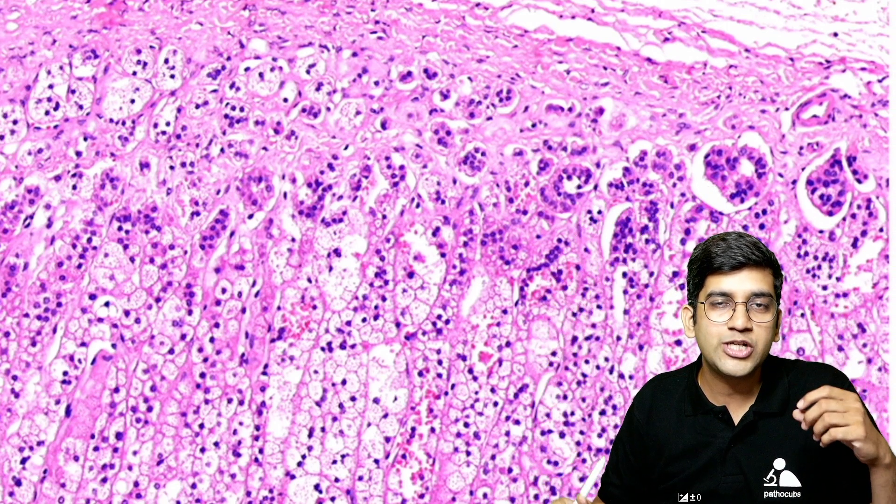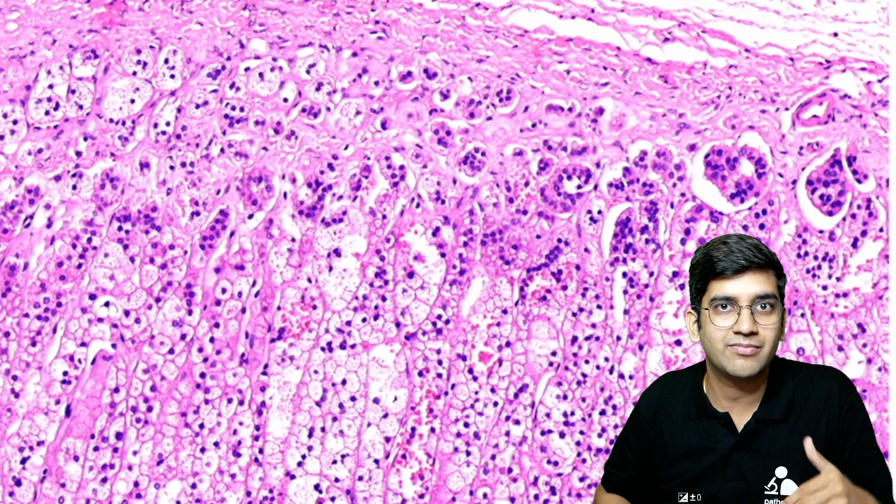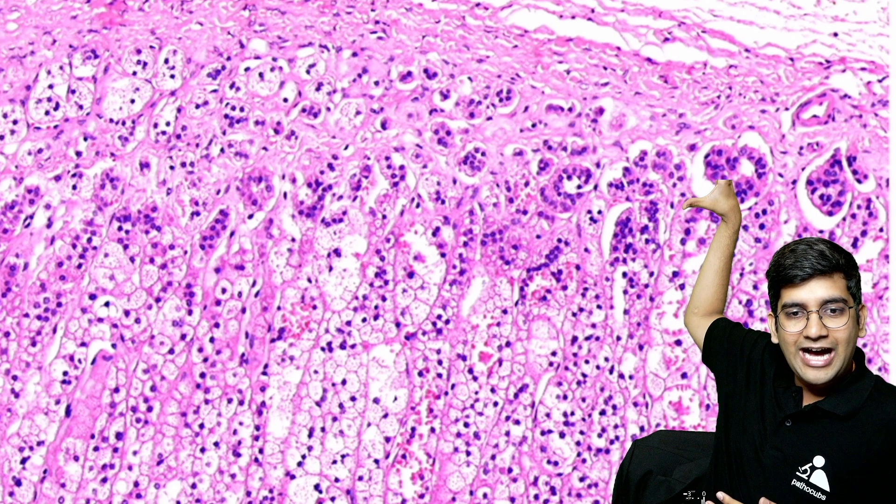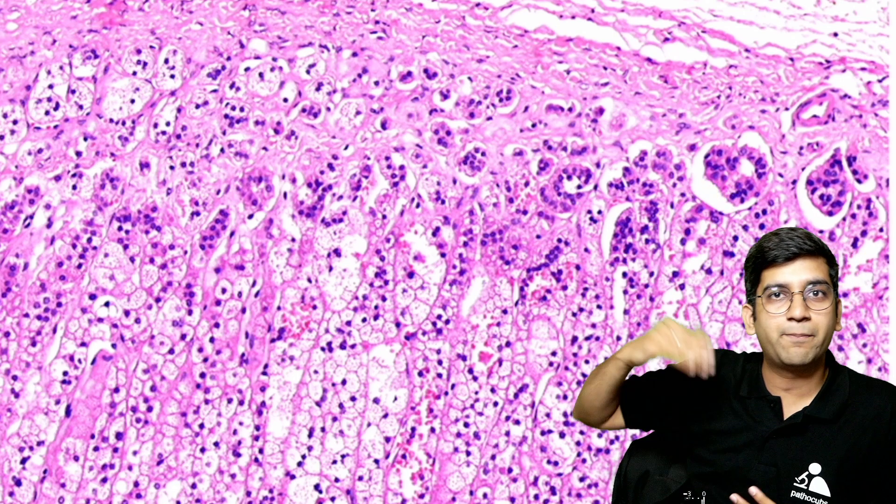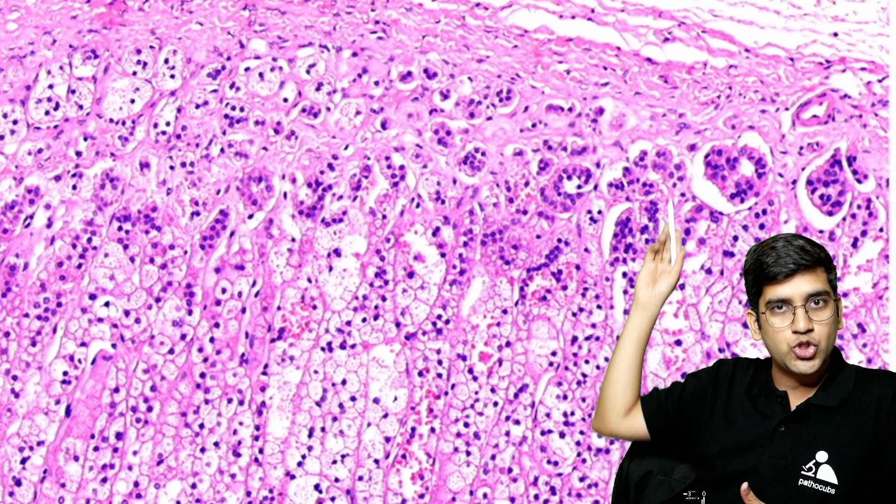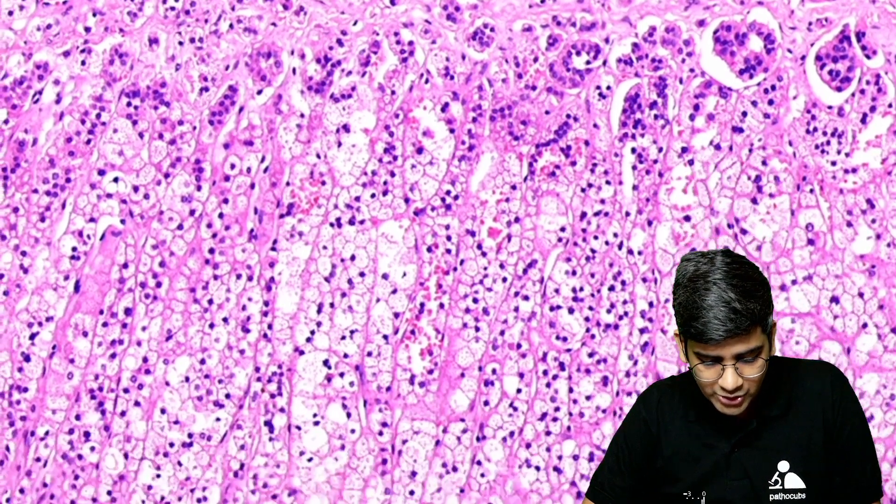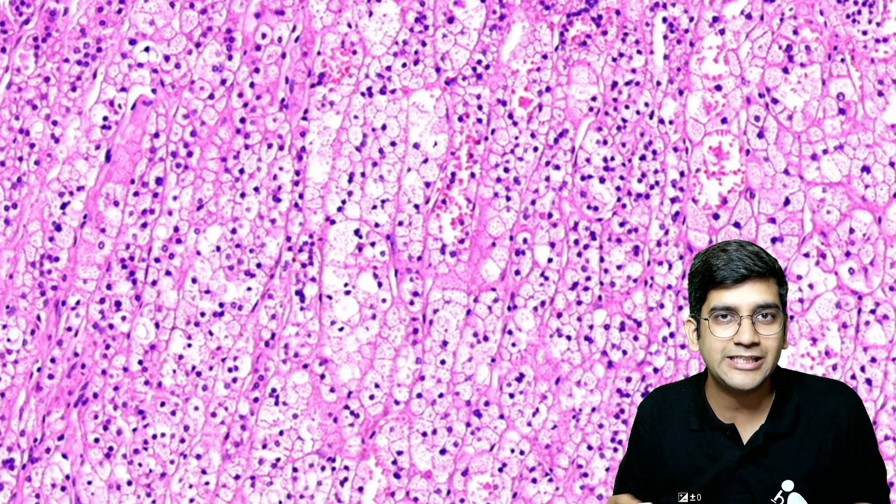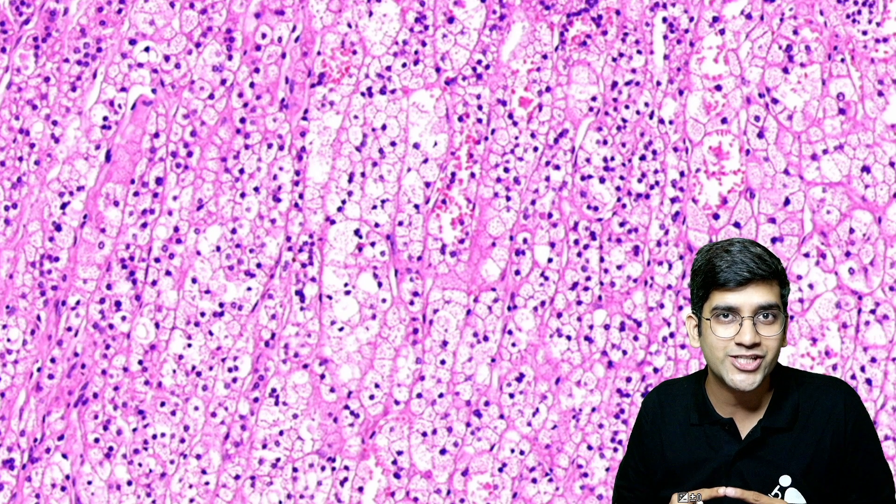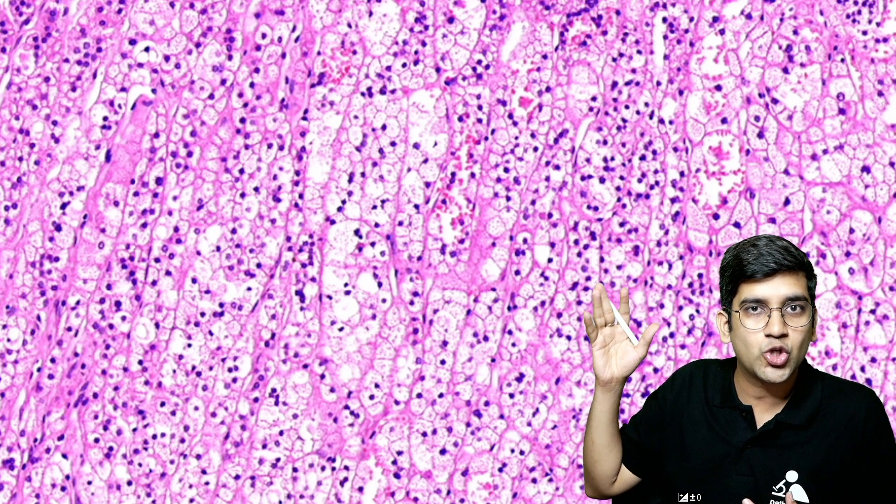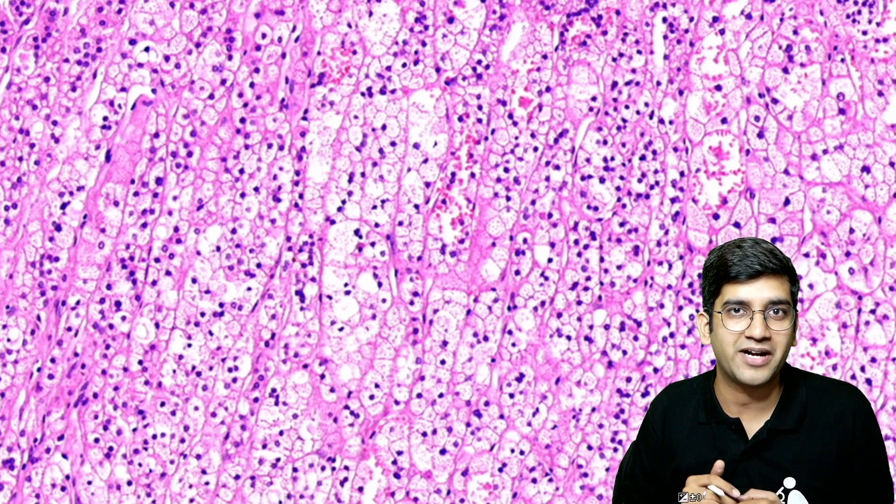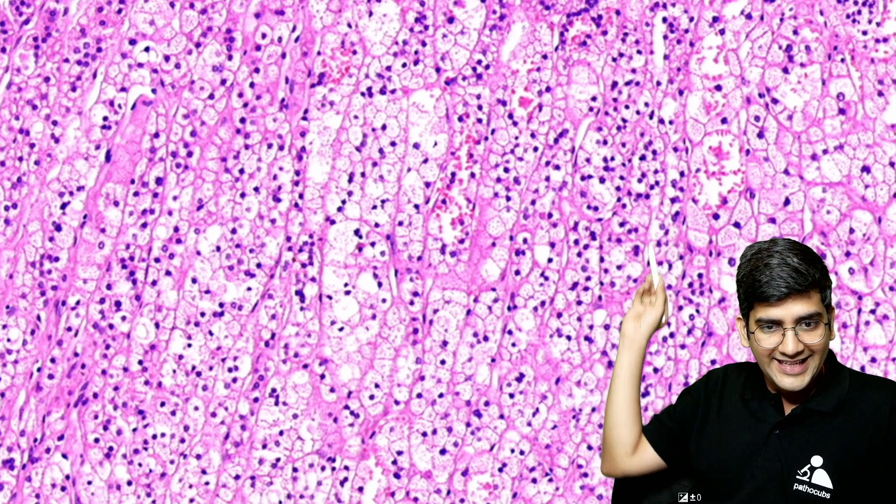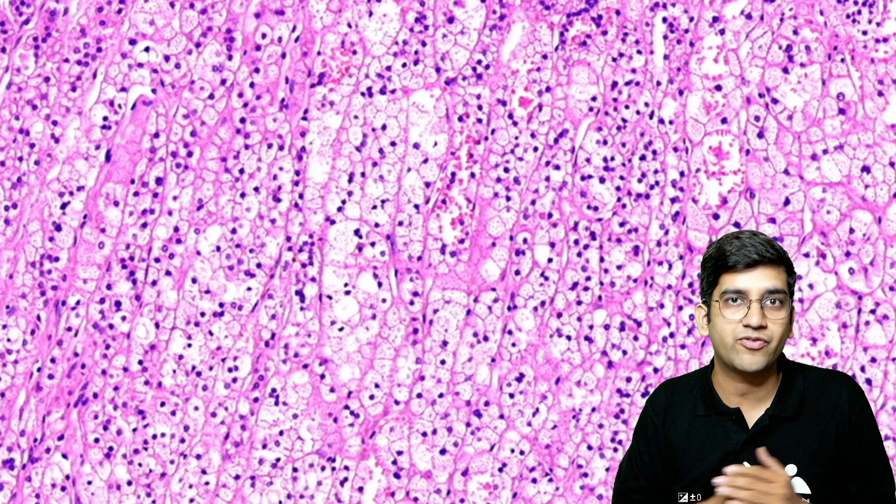The entire layer where you have blue cells with very less cytoplasm like a round like a glomeruli like a nest of cells that's your zona glomerulosa. It's hardly little it's very very little like it's not predominant. You have the capsule on the top and this part is your zona glomerulosa it looks like a glomeruli. When you go down clear completely clear completely bubbly which means the entire cytoplasm is filled with steroids filled with lipids. That's your zona fasciculata the GFR the F part here fasciculata.